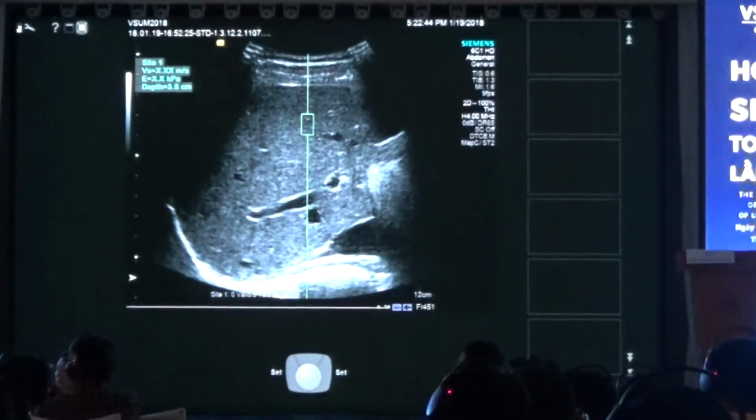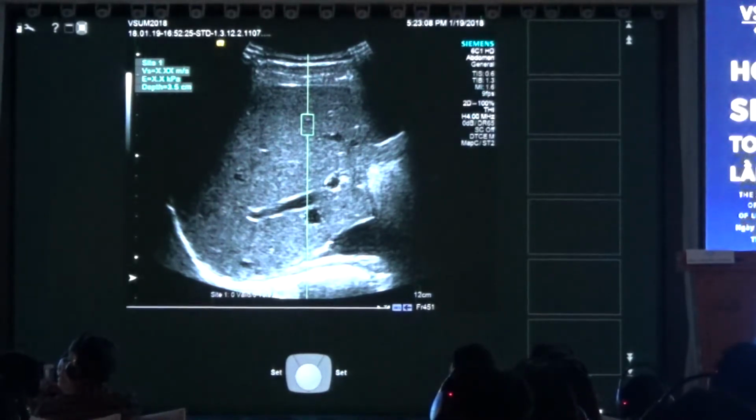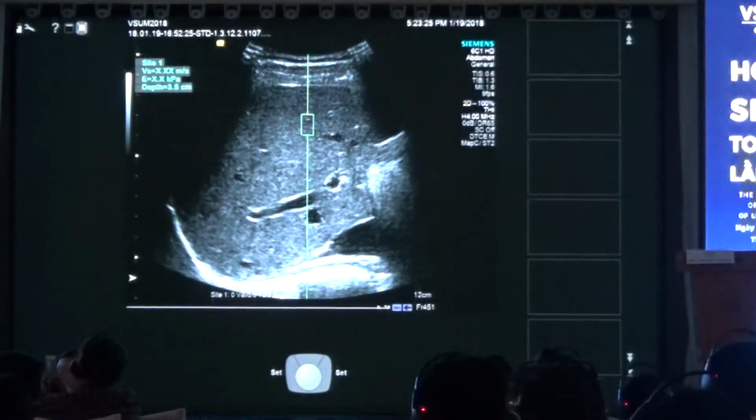And before I start, I also do a little bit of ultrasound, and I might show you one or two more tricks. I've shown you this position, which will show you the portal vein, right liver vein, right adrenal gland, and Morrison pouch for free fluid. In many persons, not in his case, also the gallbladder and the pleura. So in this position you get almost all the information from this side which you need for an emergency care patient to decide if you can sleep further or you need to work. So this positioning is also of importance.